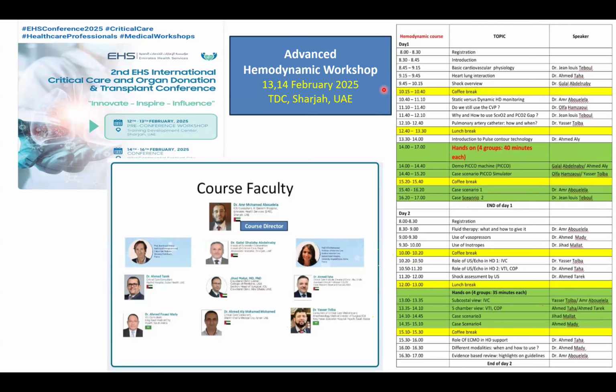So I think there will be some limitation in stroke volume variation in cardiac tamponade. Yes, obstructive shock in general, in massive pulmonary embolism. Can we depend on stroke volume variation? Yes, you can rely on it, there is no limitation. This will reflect if you give fluid, whether this will change or not. I think there is no restriction. Yes, it's still reliable. Thank you.